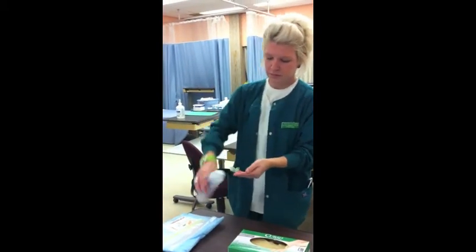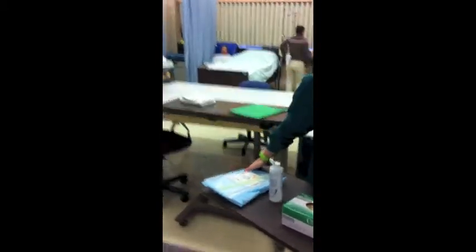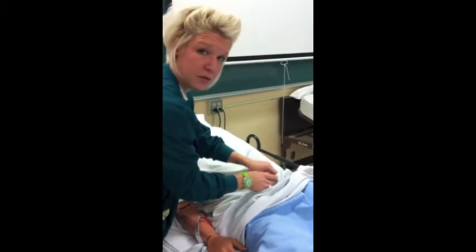I'll check his pulse, so I would grab his radial pulse. Hi, Mrs. Alvarez. How are you? My name is Kristen. I'm going to be doing an assessment on you, your abdomen, before I change your colostomy bag. So I'm just going to pull the curtain again here, make sure that there's privacy. I'm going to expose just her abdomen.